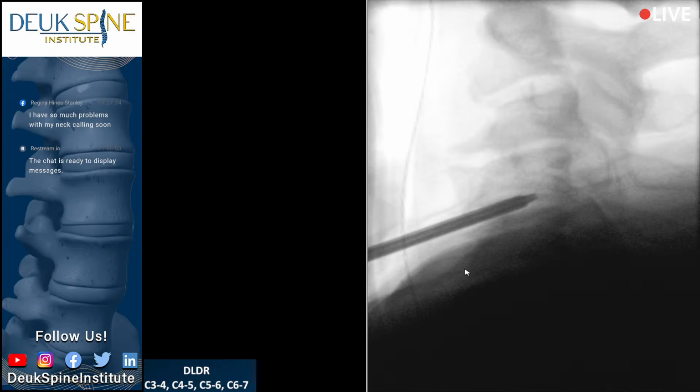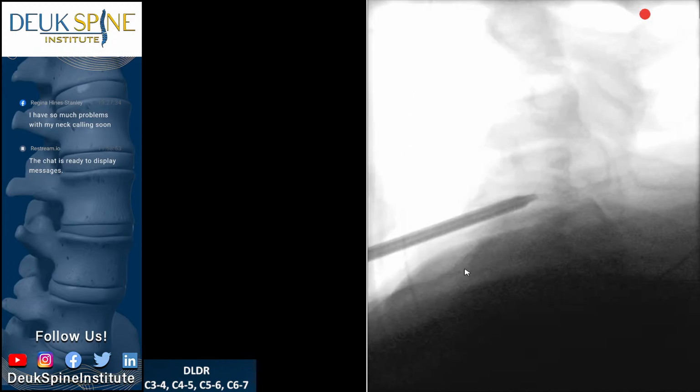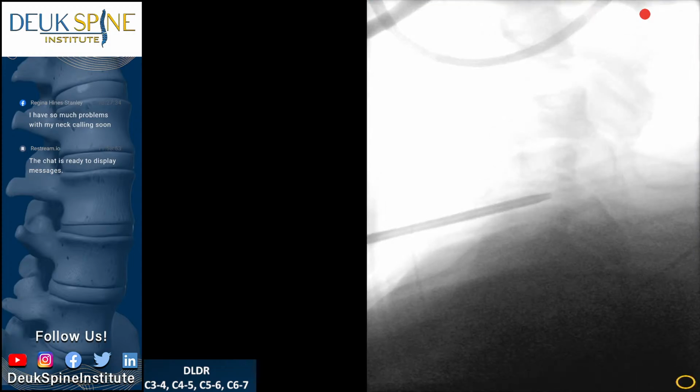All right, and I think we're going to go down. Easy now. I want to go down to the next level, so let's try that. That next level will be 5-6. Everybody ready? So the first thing I'm going to do is leave the dilator and take out the tube. And Luis, I need you to look at the tube and make sure it'll be able to come out. Ah, it's sliding out, Sean. So that's a good sign.